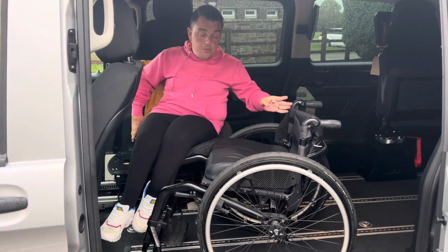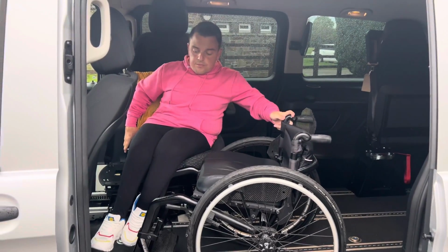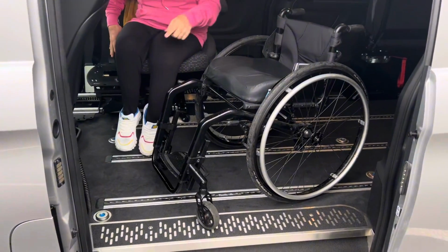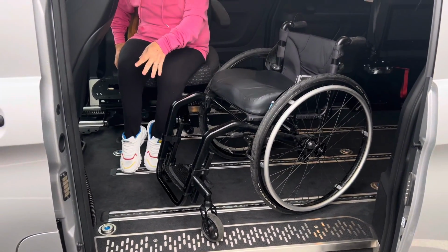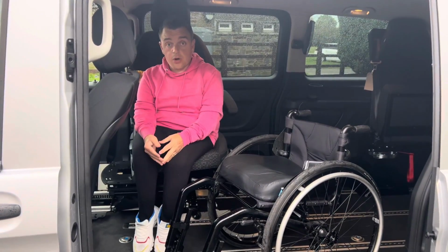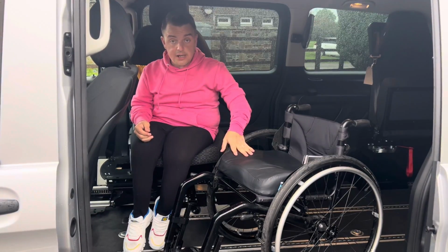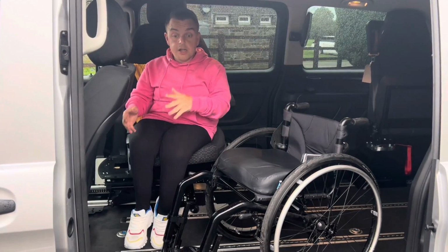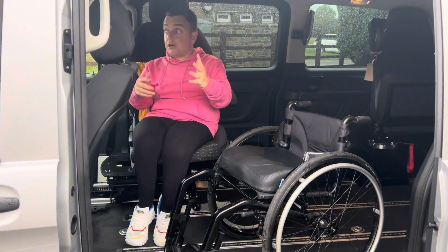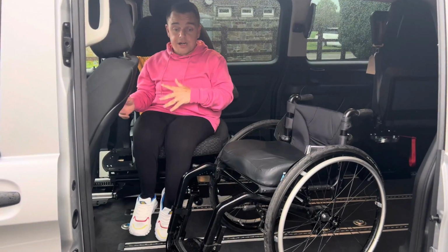So what you would get if you were traveling alone, for example, in the floor here, there are little points, as I call them, where you get your attachment fitted to the floor, and there would be a seat belt sort of thing, like a harness to strap your chair in. So if you are alone and you're driving, your chair isn't going to be flying around the back of the van. And if you did have to stop quickly, your chair is going to stay still. It's not going to come flinging into the front.